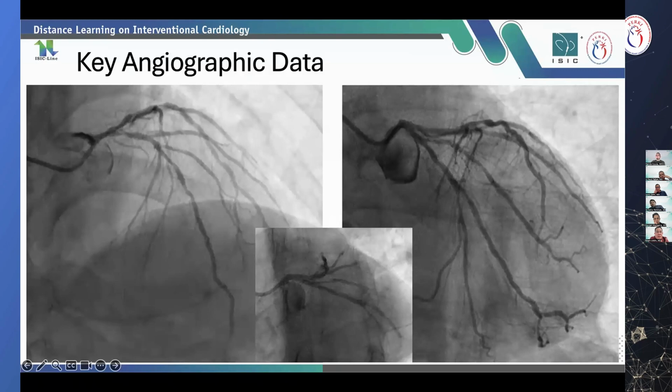But in the angiography, there is a diffuse disease and the side branch may need the bifurcation, non-left main bifurcation, in the diagonal 2, because the diagonal 2 may be size 2 or more, and there is a critical lesion. And then second, the left circumflex, OM2 is so big, but the distal of the LCX is slightly tight.